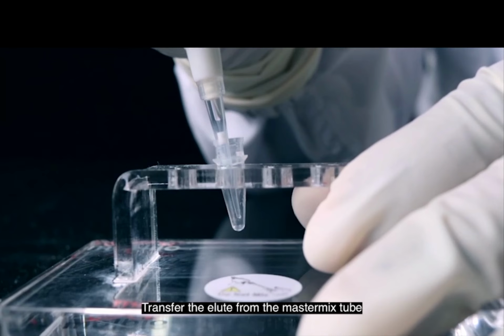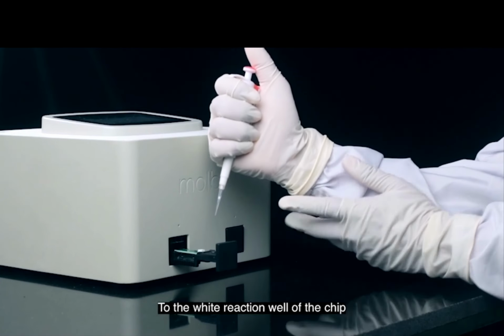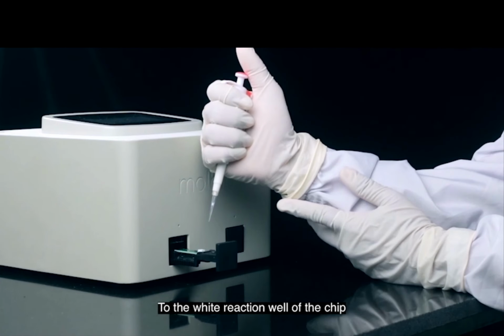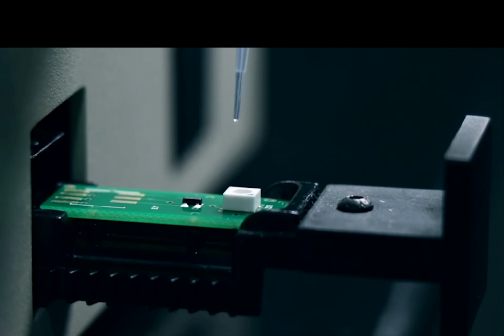Okay, so it will take all the amount. Then your chip is kept already. Use your other hand to support your pipette hand. Otherwise, sometimes there will be some shaking, and you may put the drop on some other place. So to prevent the shaking, always kindly support your pipette hand with the other hand and just go above it.